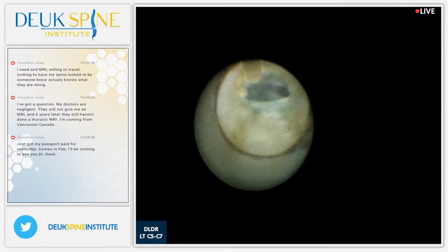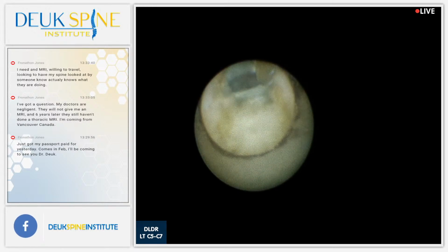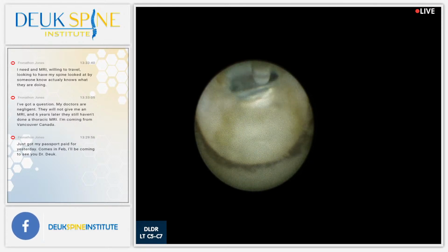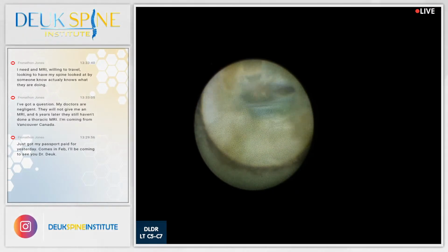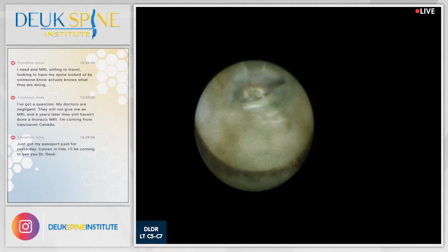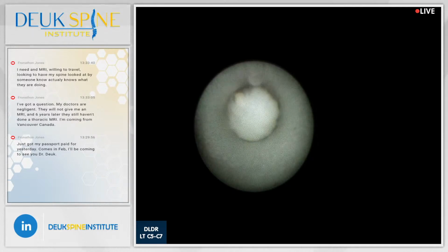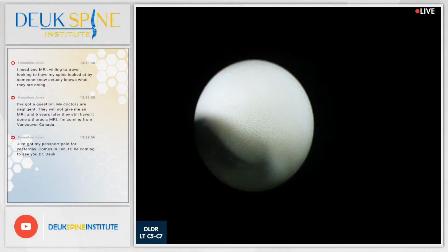So yeah, this young man did not want to have a fusion. He did not want to have a disc replacement. He did not want to have conventional spine surgery. He knew there was something better. He found us, and he's here with his mom. And this will be his Christmas gift. I hope that he gets out of pain. That's a piece of herniation right there. So I'm going to have to look around a little bit. There's a piece of herniation coming out.